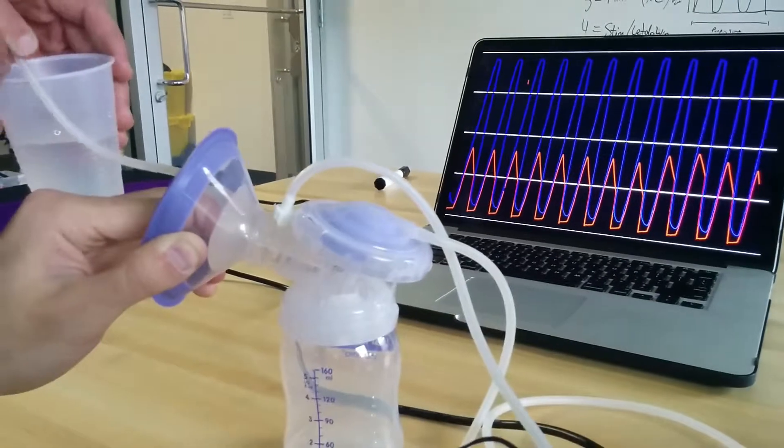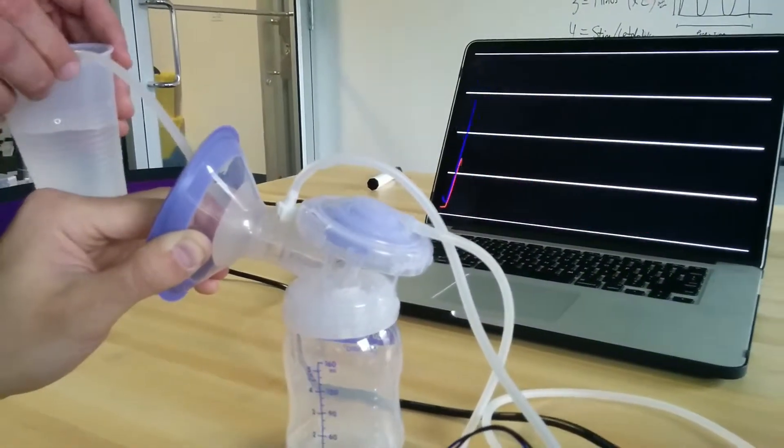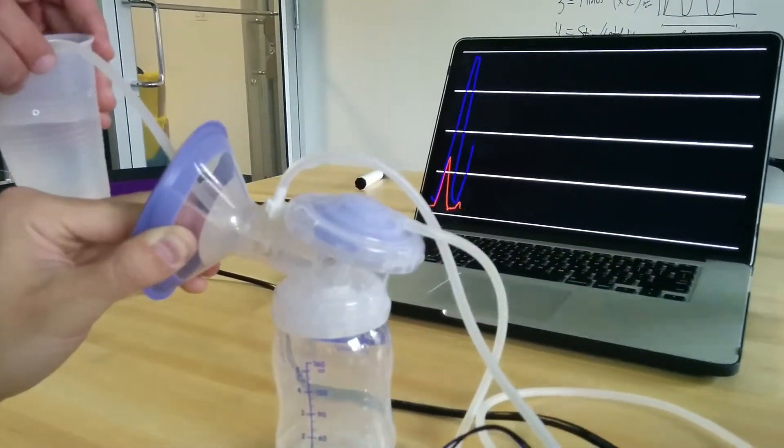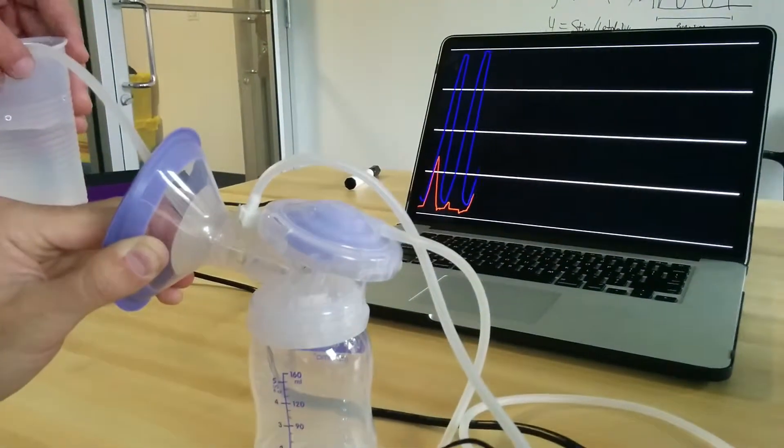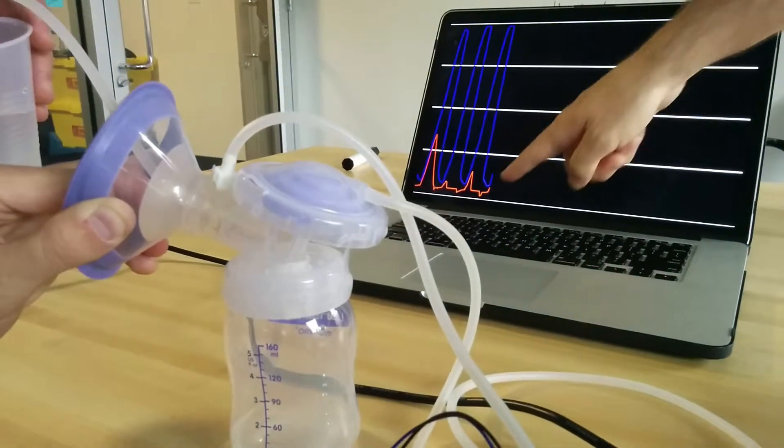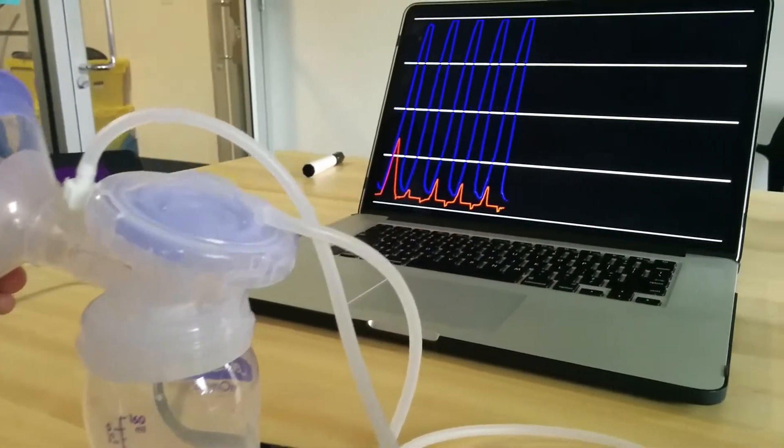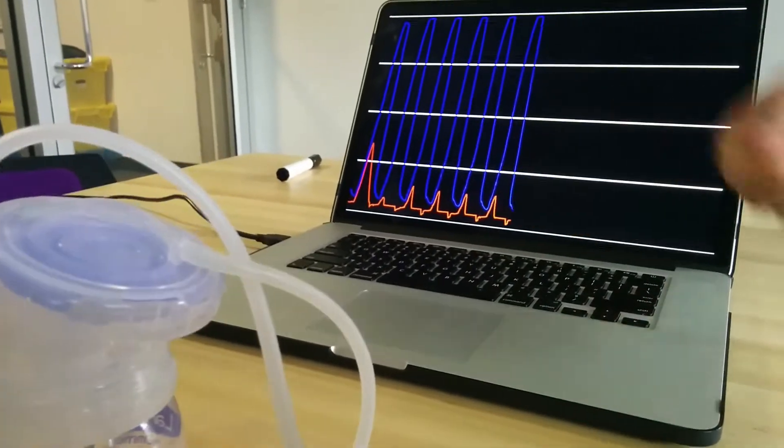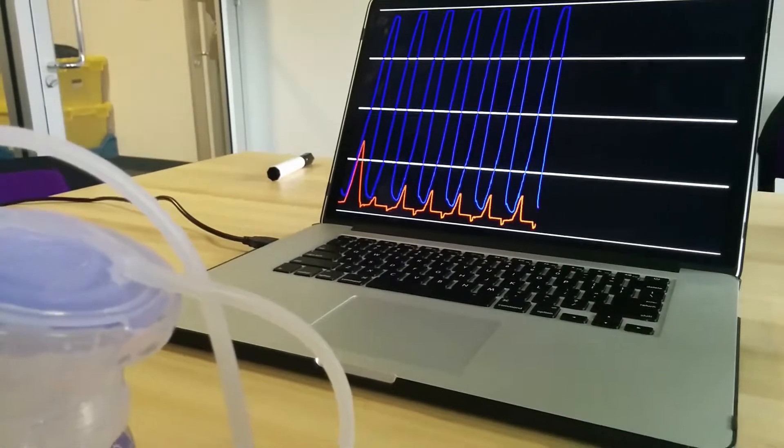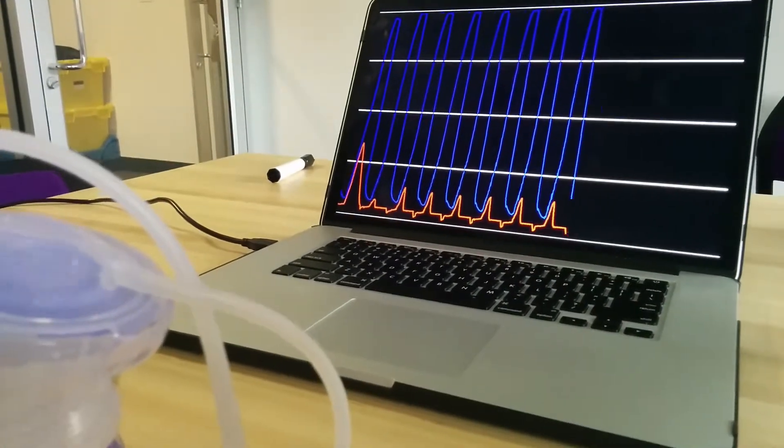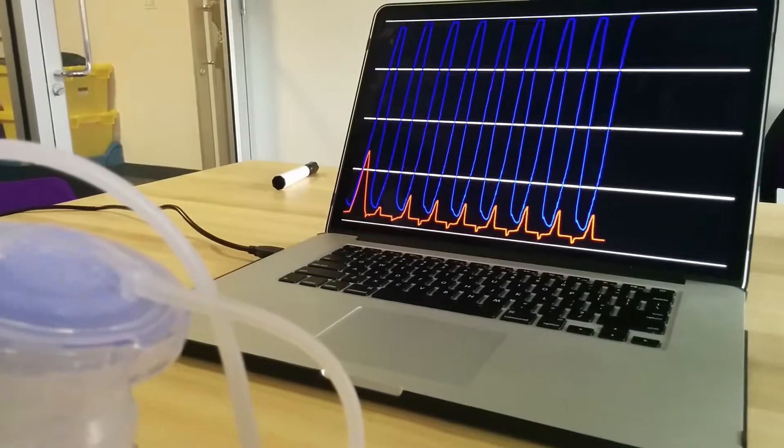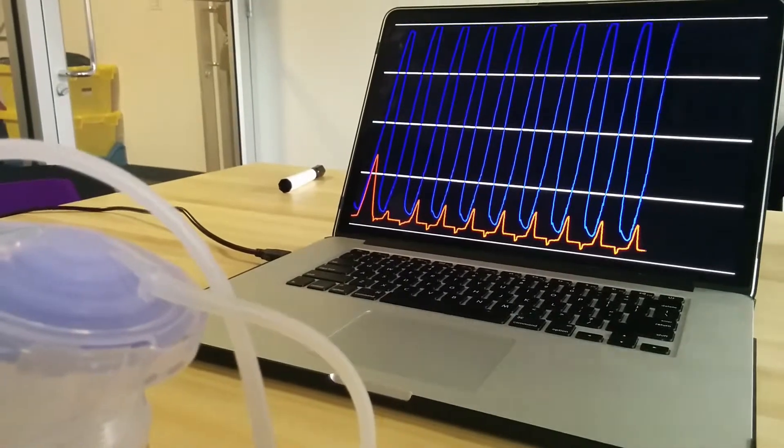If we put the tube into the water, simulating milk flowing from the breast, you can see there's a bottom of this wave that indicates the water is flowing through the tube.